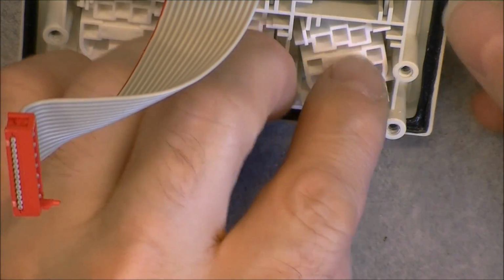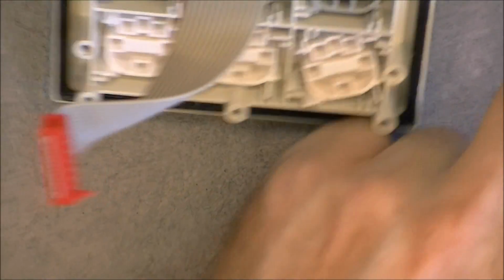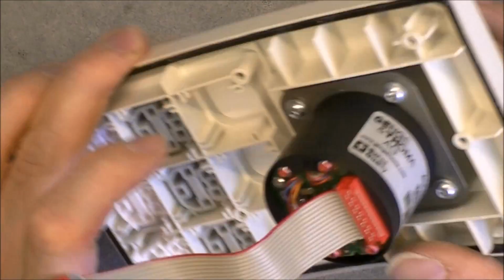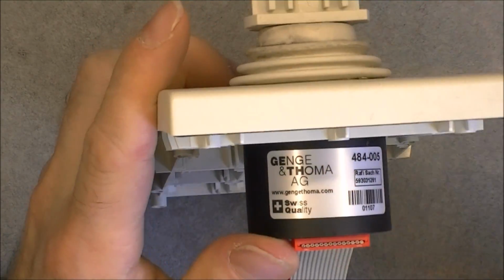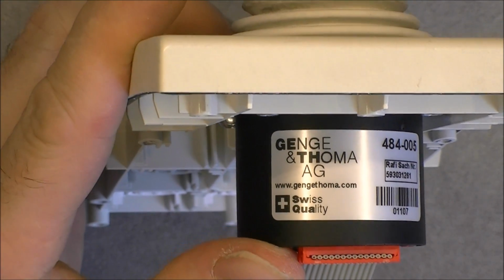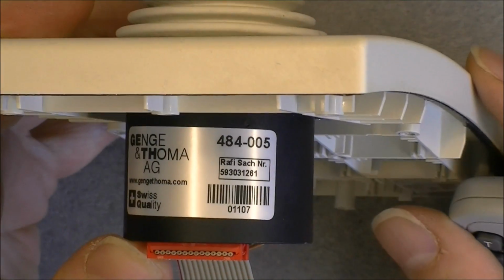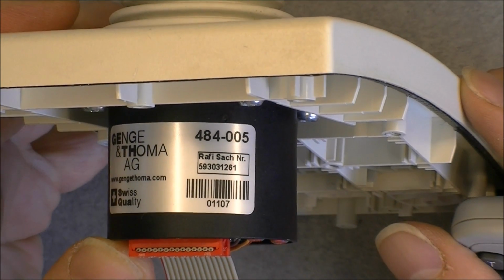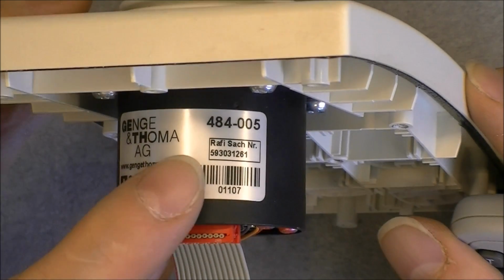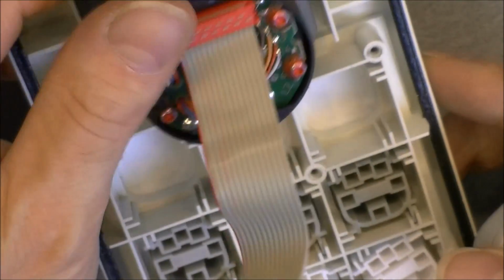Okay, so for sure it is expensive, this thing, but I do not think the cost of the parts justifies the price of $4,000 yet. So we will now have a look at this controller. Seems pretty fancy, made by some Swiss company, as you can see. And here must be the model number, and it must be a custom order, so there is a part number here.